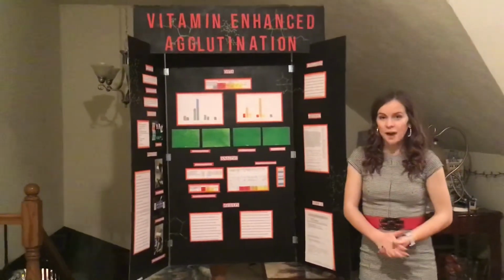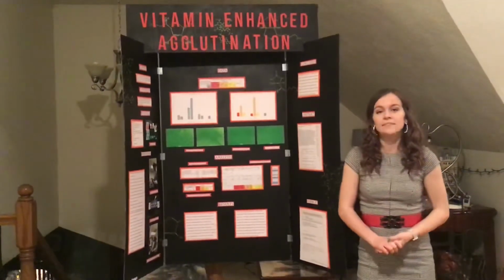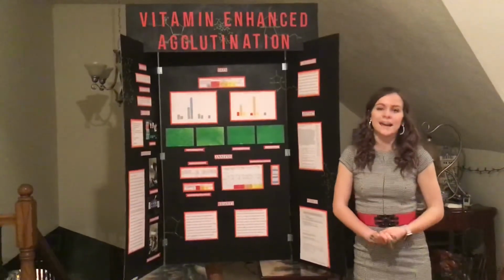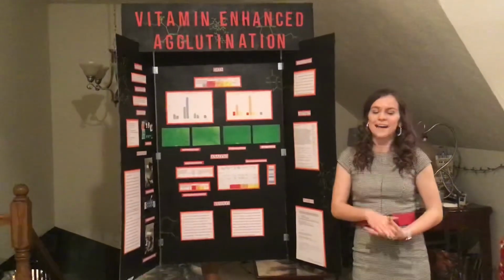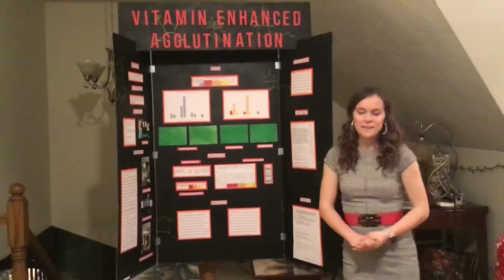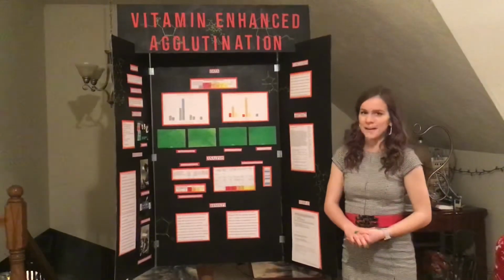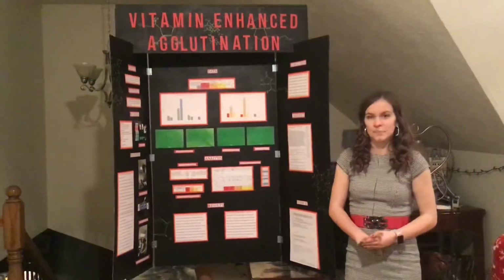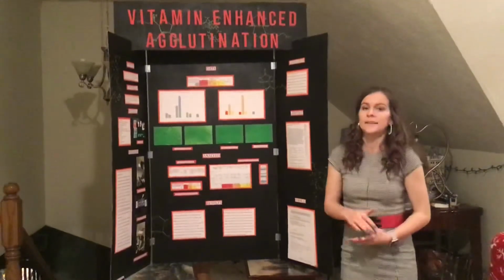I tested this hypothesis by varying dilutions of antiserum at 1 in 5, 10, 20, 40, 80, and 160 dilutions. I then put these into a well slide with the antigens, the salmonella antigens, and with my vitamin solutions. I then put these under a microscope after waiting for 10 minutes and checked the agglutination patterns. The highest dilution at which I saw agglutination present was the one that I recorded.